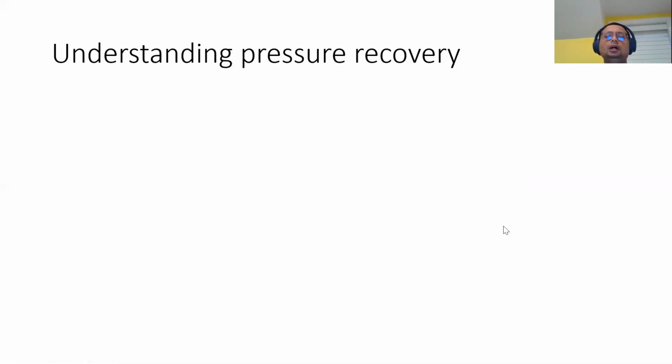Okay, now whenever we assess prosthetic aortic valve or even prosthetic mitral valve, we realize that the patient has a problem when there is increase in velocity or increase in gradient. Okay, so the abnormal velocity that I take as my threshold is more than 3 meters per second. So if any prosthetic aortic valve has velocity more than 3 meters per second, then I start to get worried.